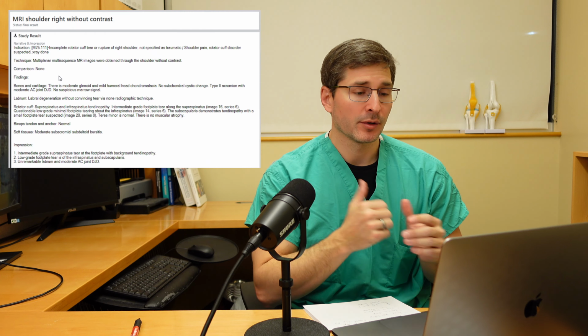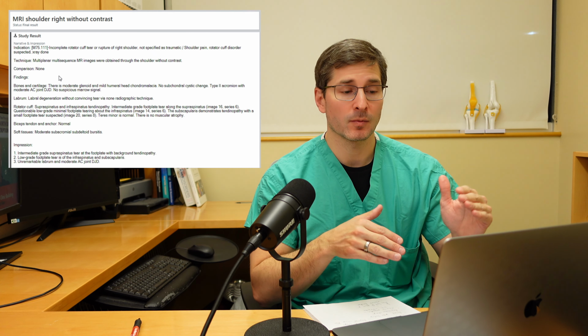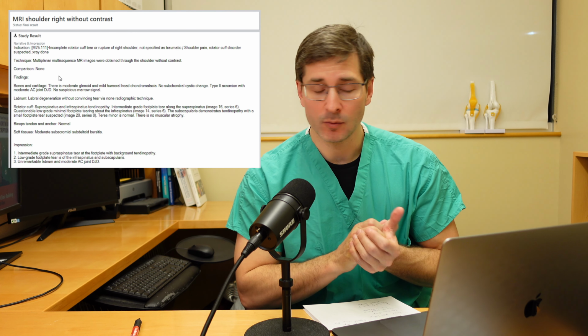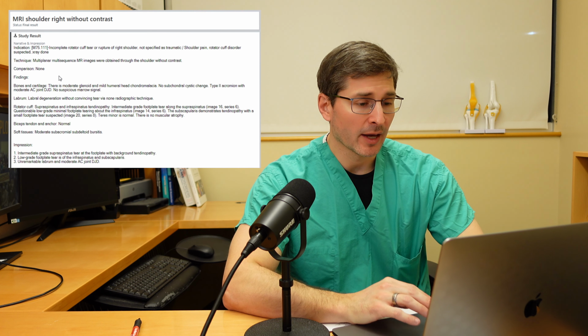Okay guys, so what I've got now on my computer is some MRI reports that I'll put up on the screen here. We're going to go through each one of these and review pretty much what is on the MRI report, and then we will kind of go through what all that means.